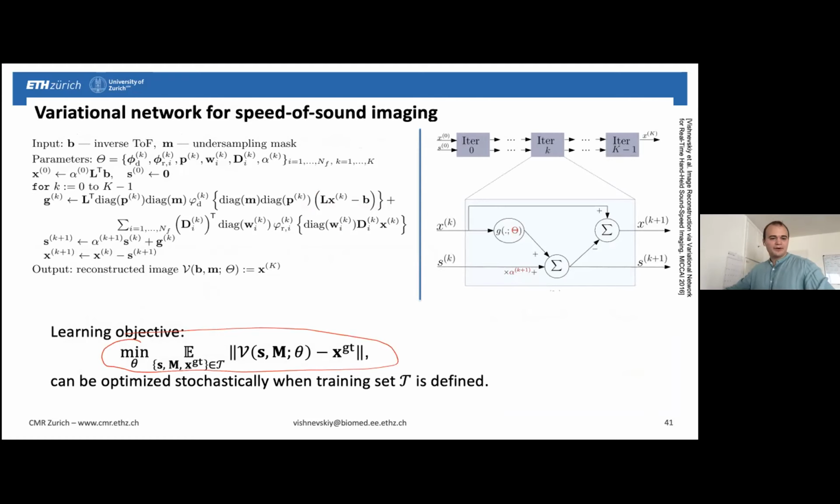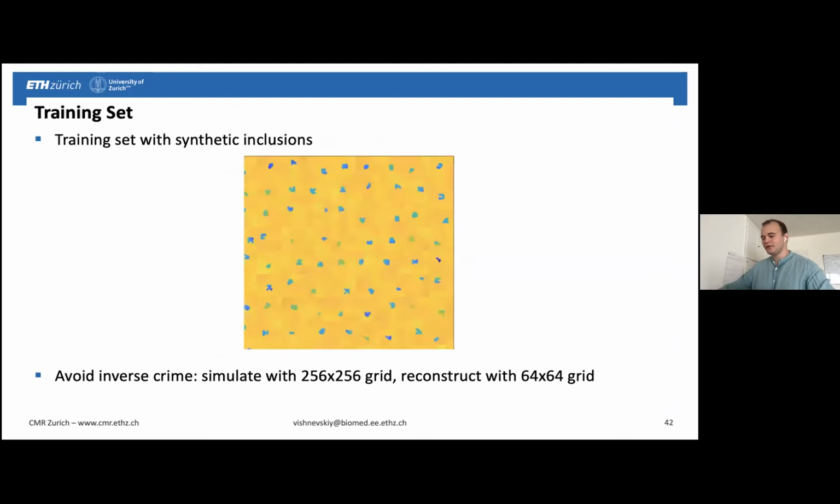So one particularly interesting thing about this ultrasound transmission tomography paper that we had is that we have no ground truth data because it's a novel modality. We don't know how to optimally sample the signal at this point. So we don't have any real training data. Even if we had a lot of time, we couldn't get this.